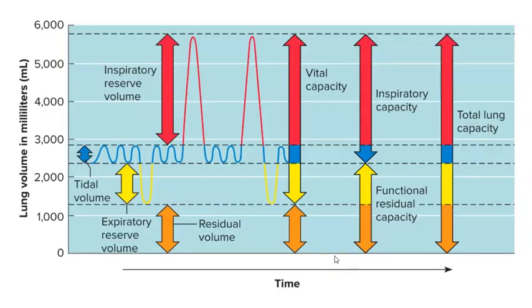Now let's look at the capacities. Remember that the capacities are determined by adding the volumes together. We're not going to look at all of them. Let's just focus on 2. Let's look at the vital capacity.